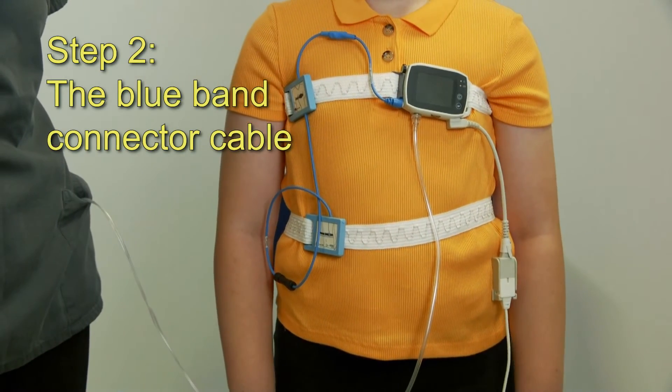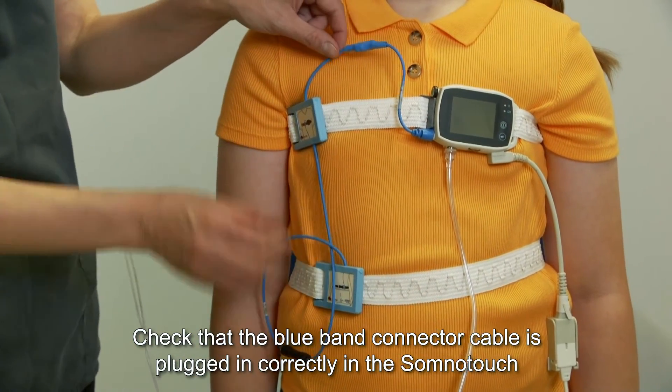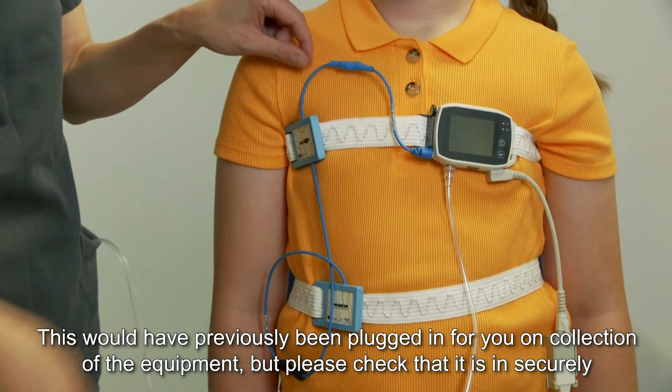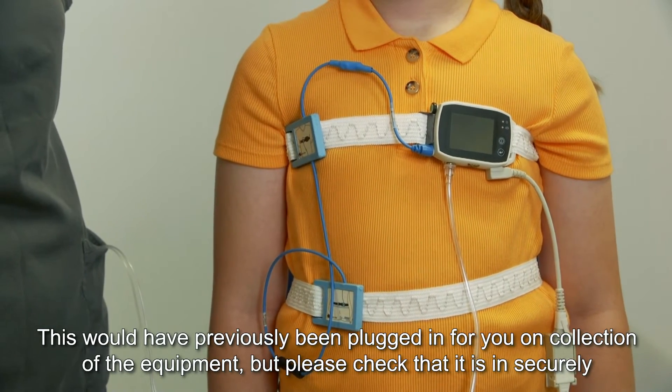Step 2: the blue band connector cable. Check that the blue connector cable is plugged in correctly to the SomnoTouch — this would be in the top or the bottom. This would have previously been plugged in for you on collection of the equipment, but please check that it is in securely.